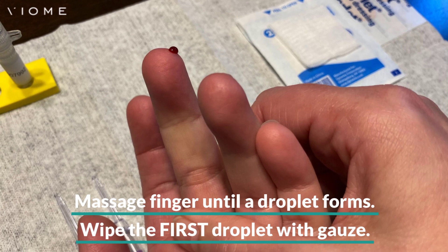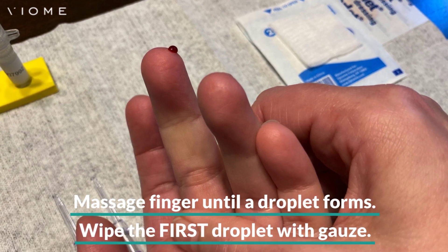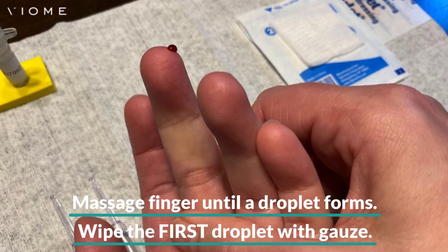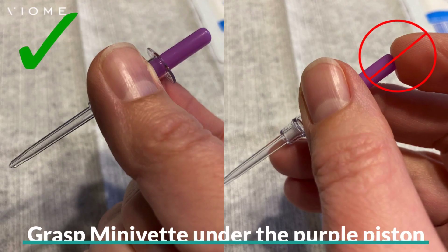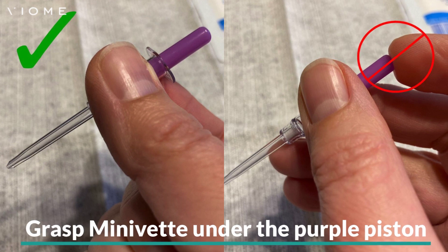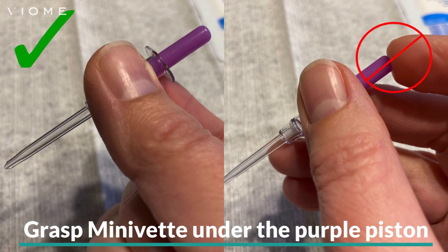Push down on the top of the lancet until you hear a click. Keeping your hand below your heart, massage your finger until a blood droplet forms. Wipe the first blood droplet with gauze, then massage again if necessary to form another blood droplet. Grasp a minivet just under the purple piston, being careful not to place your finger on top of the piston or push down on the piston.